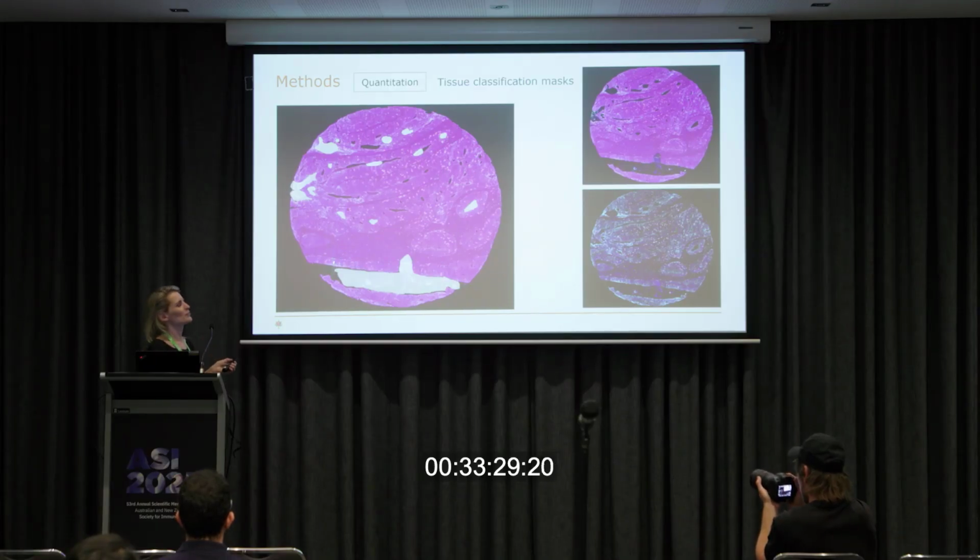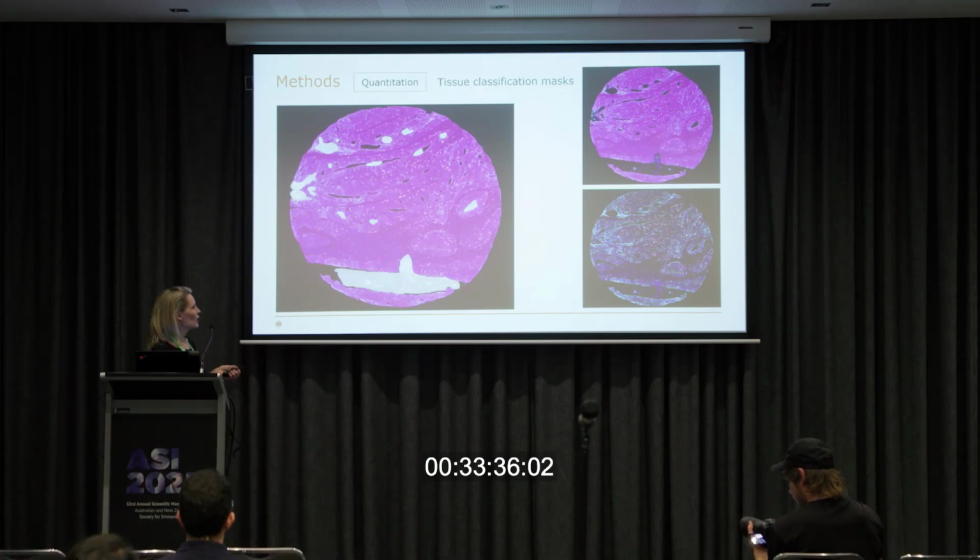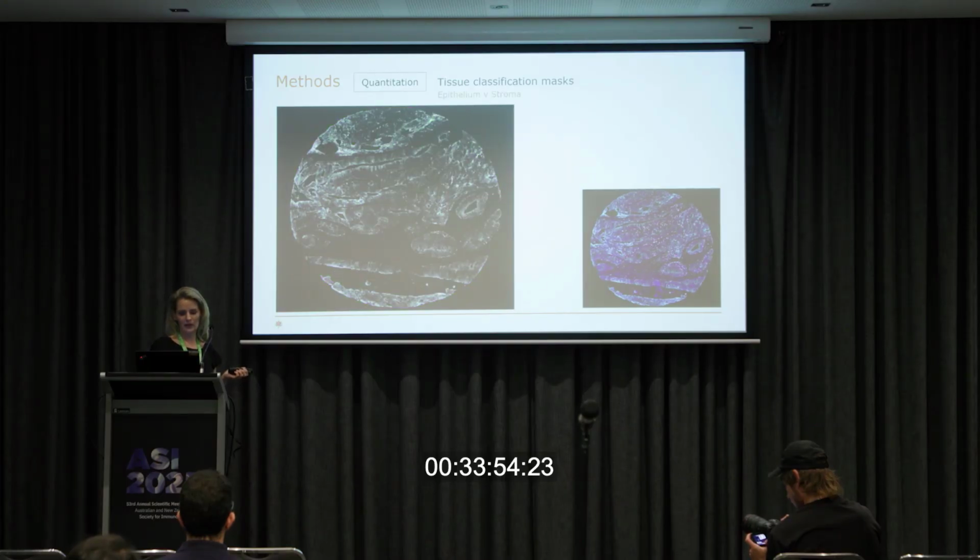This one probably has more annotation than we would need, but you can see here there was a fold in the tissue, and unfortunately that's part of this. We want to get rid of those, because if you have folded tissue you're going to get erroneous results. Also, these are bowel cancer samples, and so we have debris, aka feces, in some of these, so those luminal areas we want to get rid of as well, so they don't confound the results. So that will be our annotations.